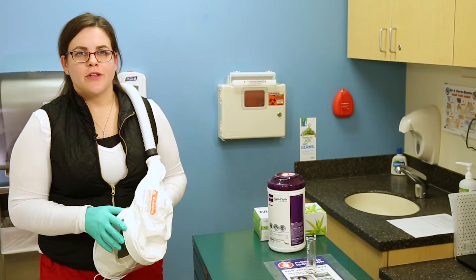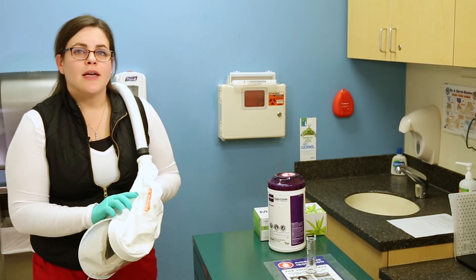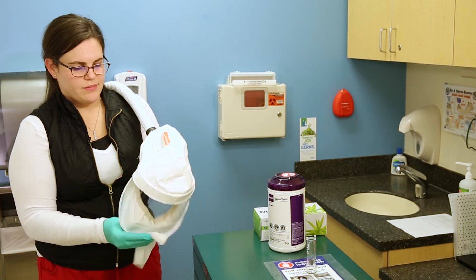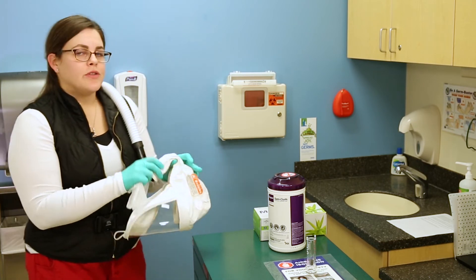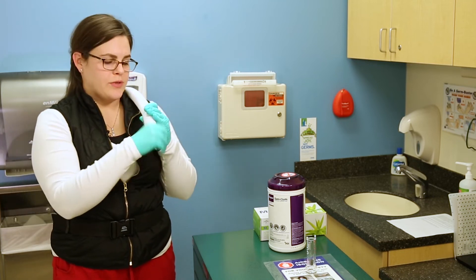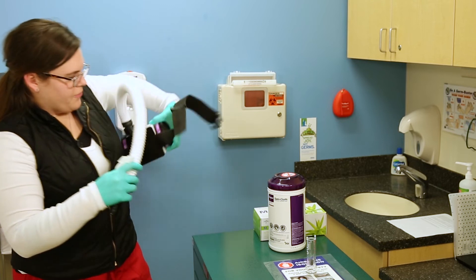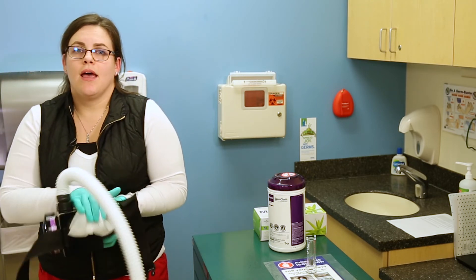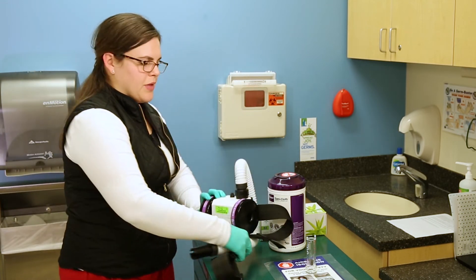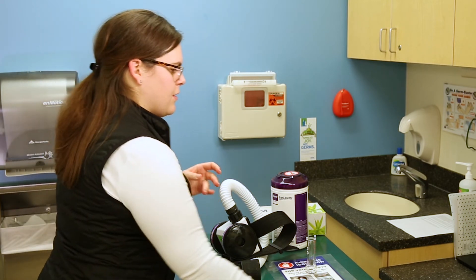After doffing your PAPR hood and turning the machine off, you then want to clean it. First, you're either going to use your non-bleach or bleach wipes as appropriate for that patient. Clean the outside of the hood and disconnect. You'll store your hood in a plastic bag hanging outside the patient's room for later use. Next, you'll clean your hose and machine, making sure to hit the contact time for the wipes that you're using. Allow to completely dry for the next healthcare worker to use. Remove your gloves and perform hand hygiene.